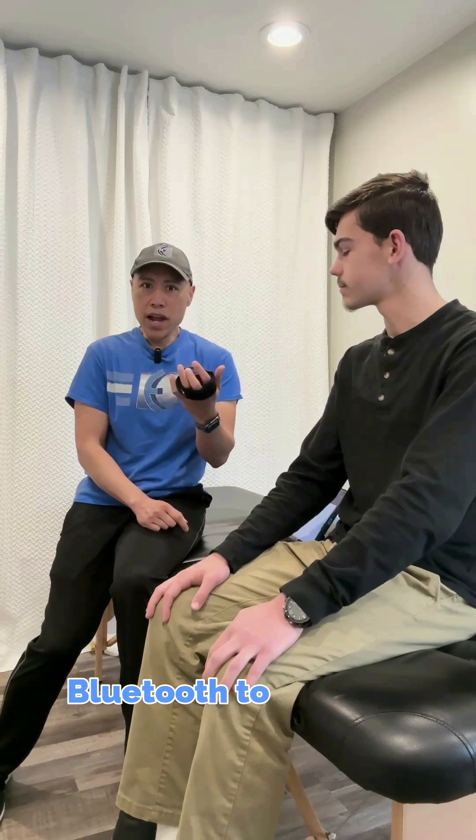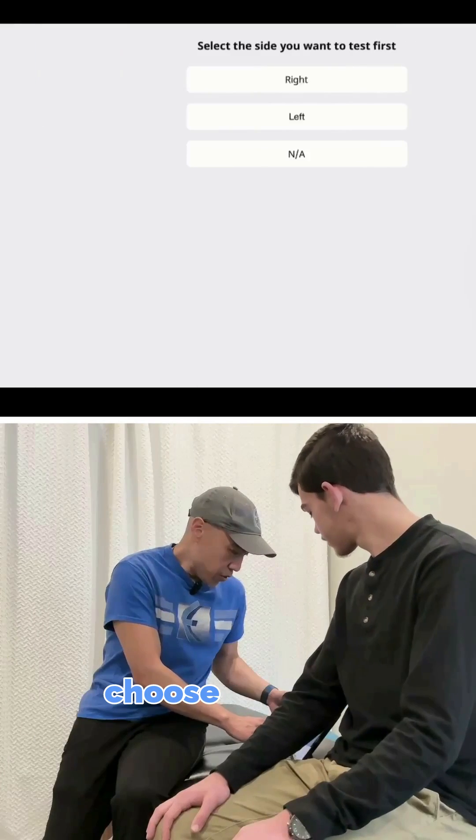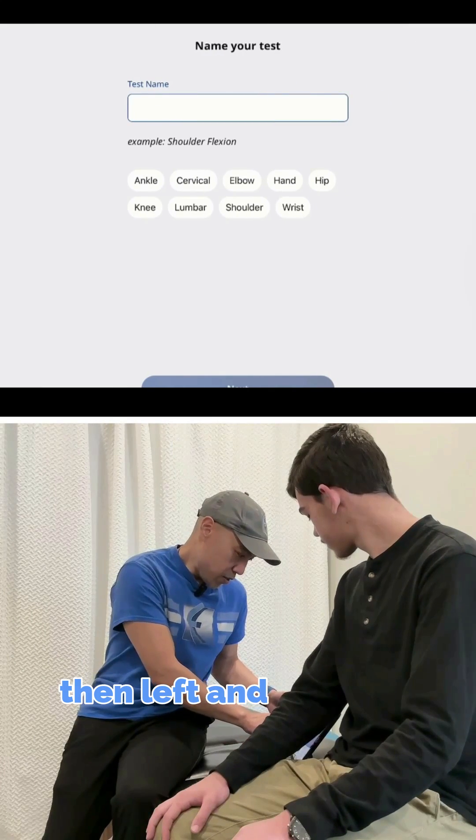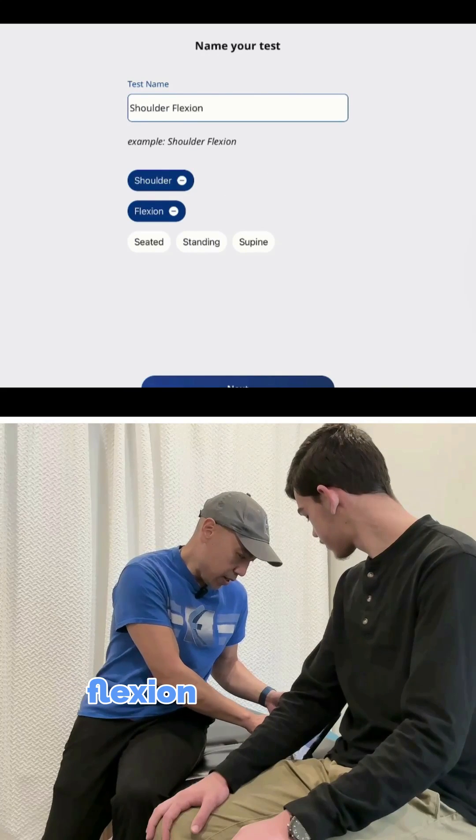I just connected it via Bluetooth to my iPad. So I'm just going to choose Strength, then Left, and Shoulder, Flexion, and Seated.